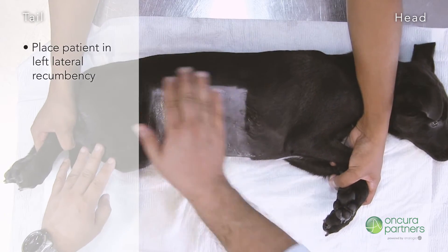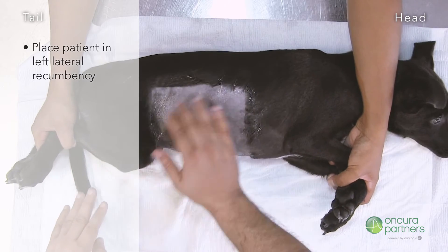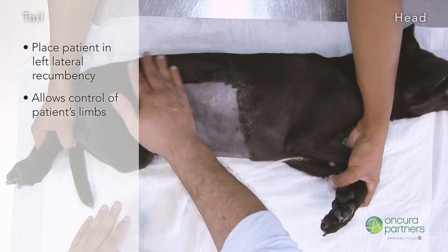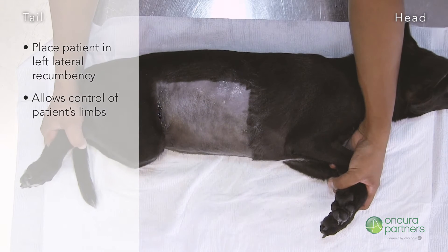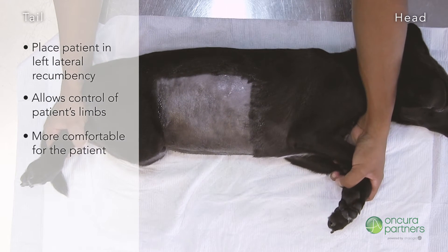Place the patient in left lateral recumbency so its limbs are directed towards the sonographer. This will allow one person to have control over the patient's front and hind limbs. This position is also preferable since it seems more comfortable for the patient.